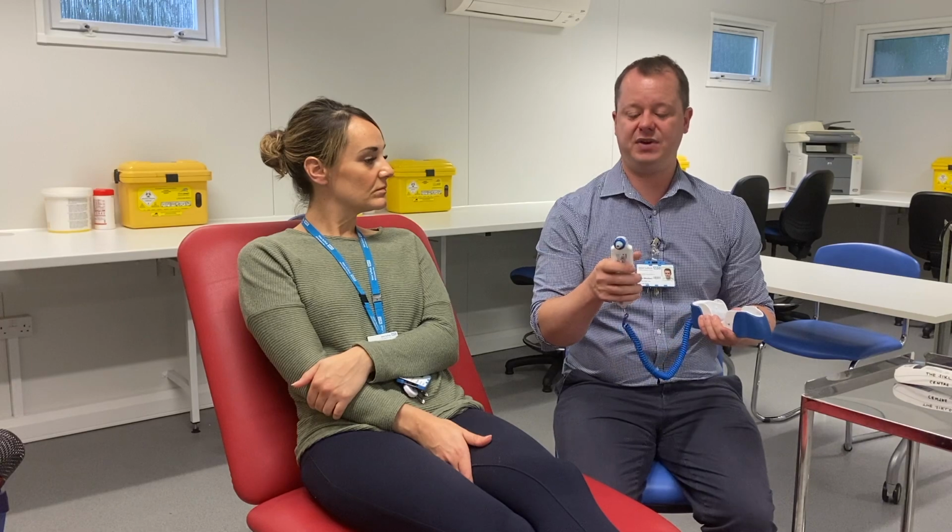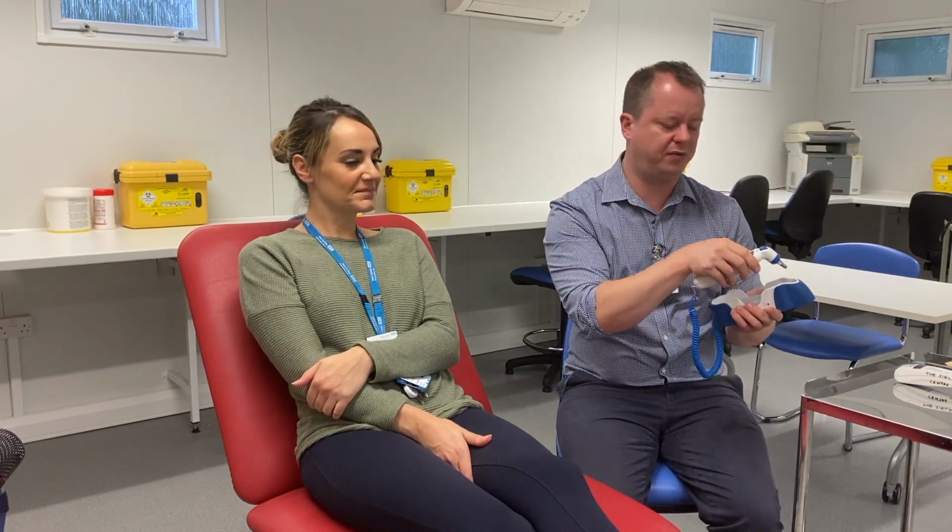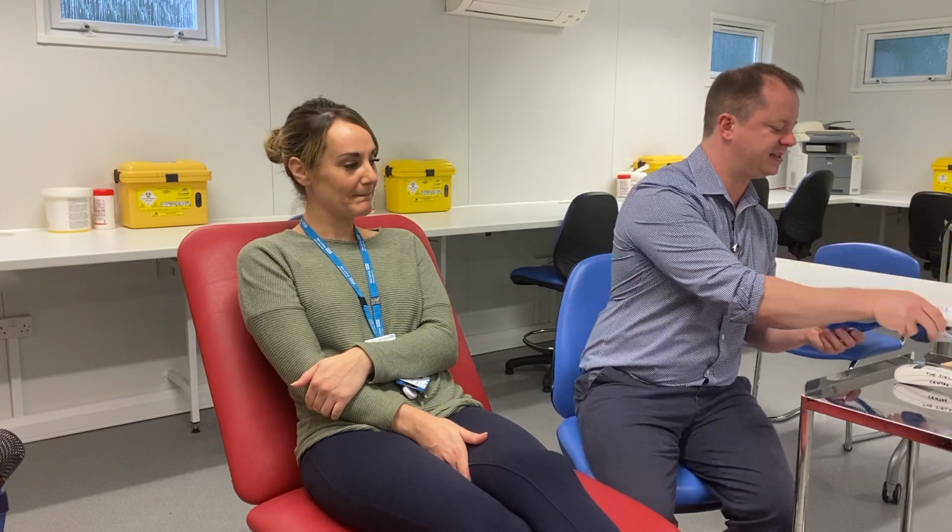Once we've done that, we then need to get rid of the cover, which we can just aim at the bin or wherever the covers go, and then get rid of the cover, it just fires off. So you don't throw it on the floor, that's just what we do for dramatic effect. And make sure your machine is decontaminated afterwards, so give it a good clean wipe.